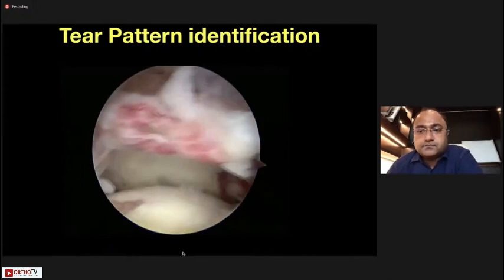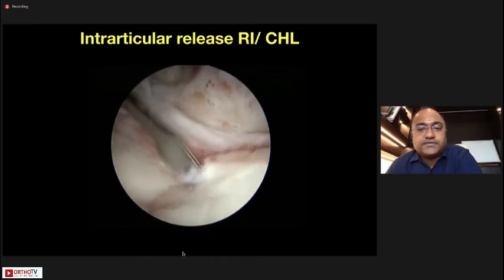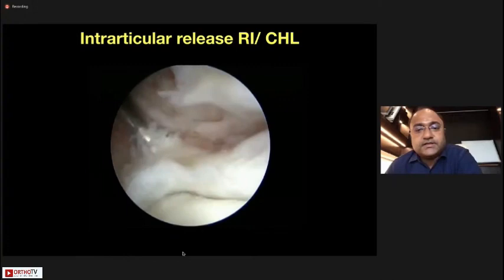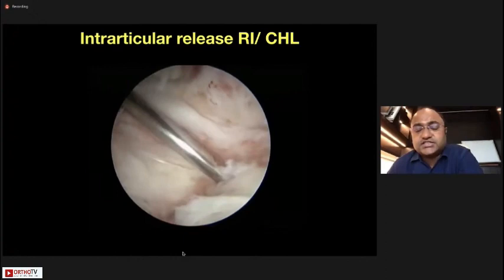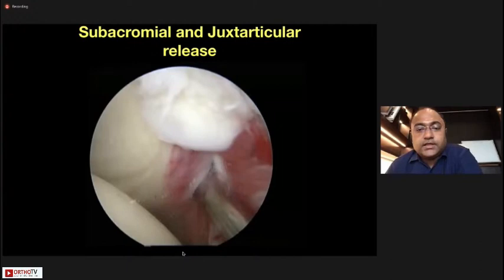The first release is an intra-articular release starting from the intra-articular space. On the left shoulder — humeral head on the left, glenoid on the right — after biceps tenotomy, the liberator releases at the level of the supraglenoid tubercle in the area of the coracohumeral ligament. As Charlie Neer pointed out in the 1950s and 60s, the coracohumeral ligament is the most important structure that contracts holding your rotator cuff back, and that must be released.